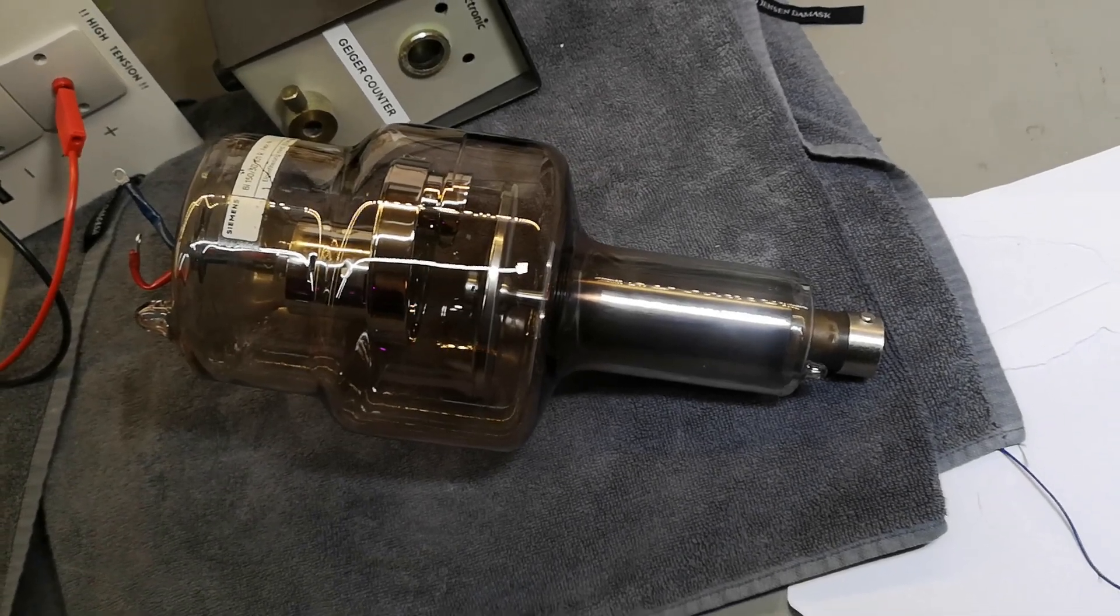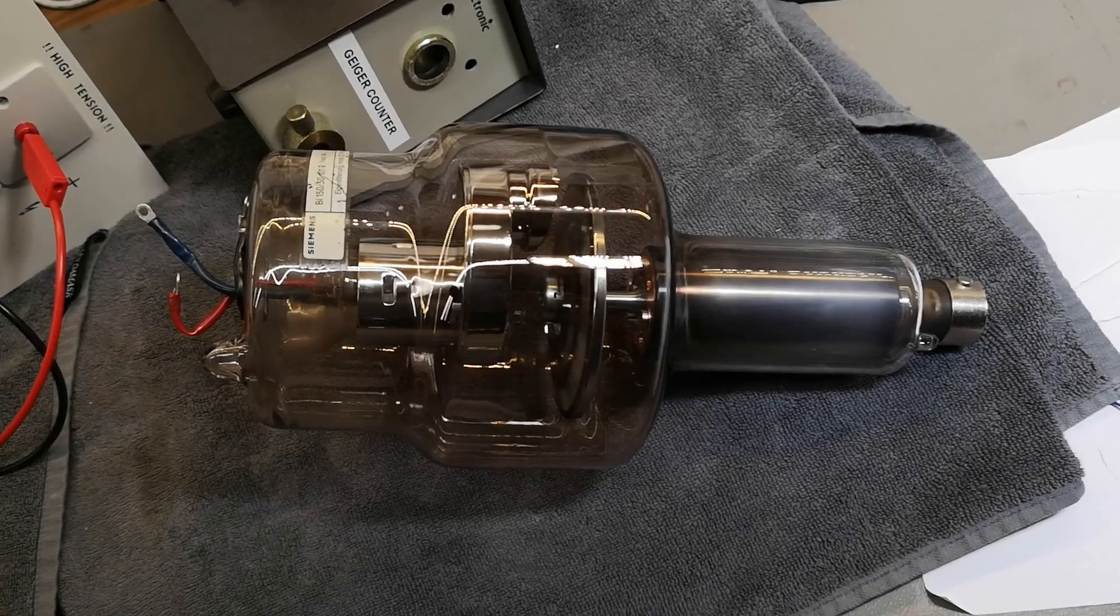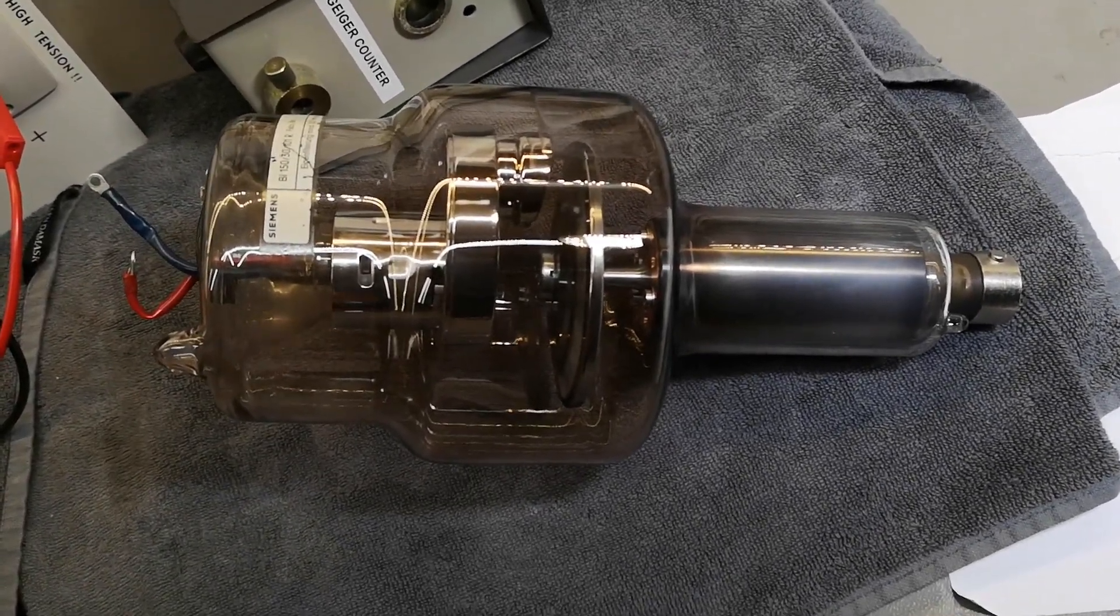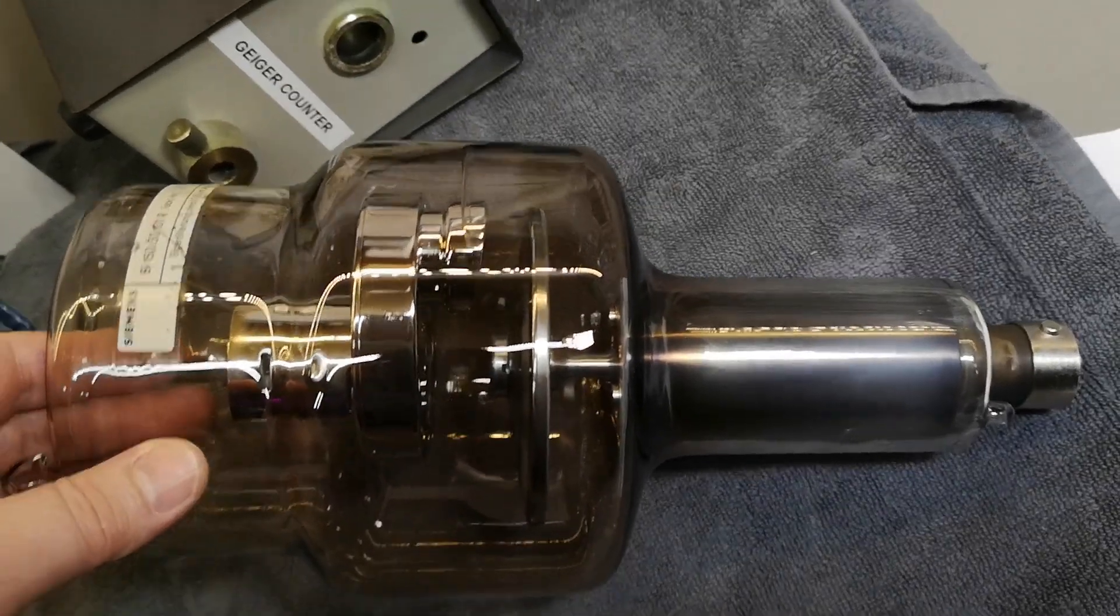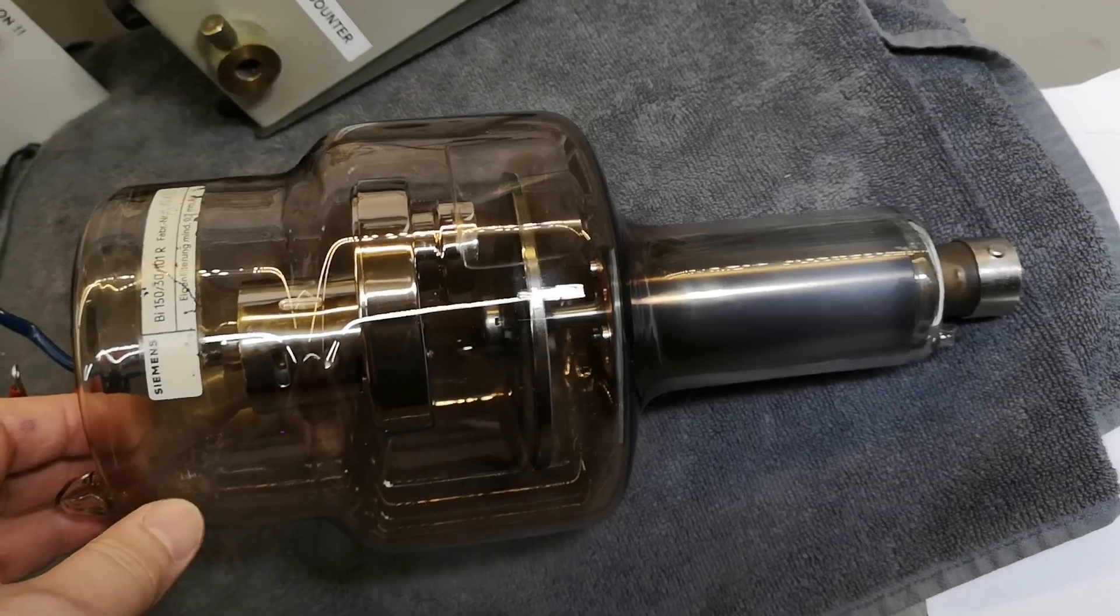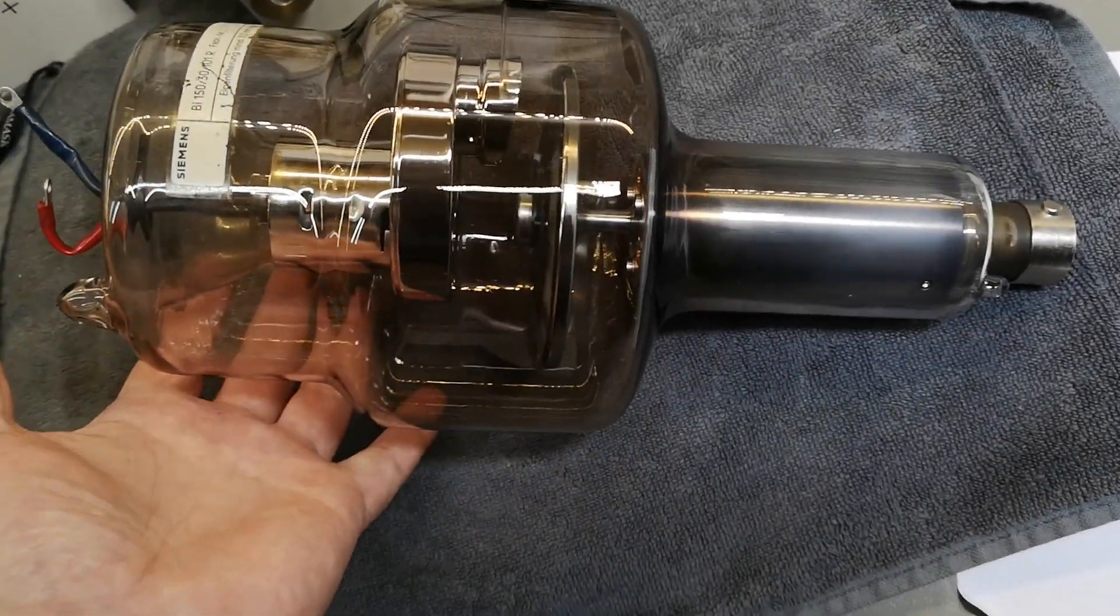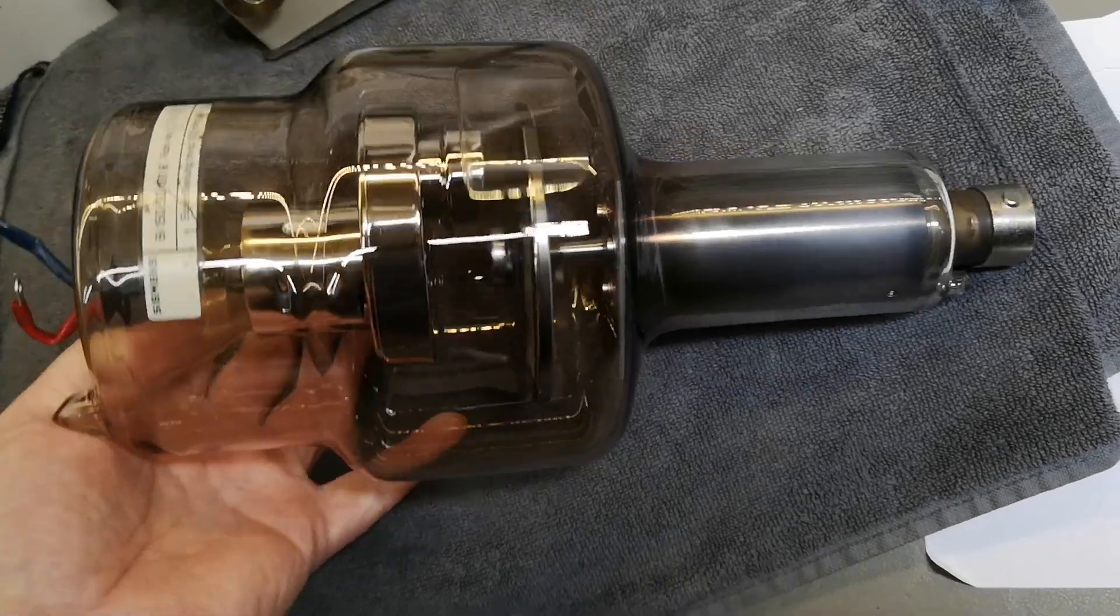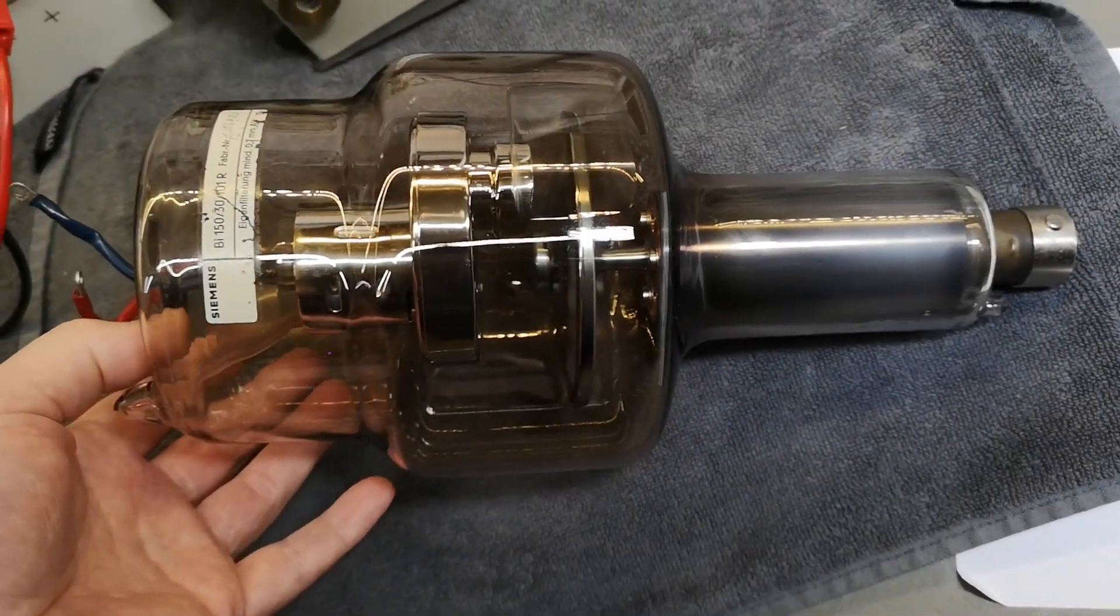Welcome to a new test and teardown video. I'm going to play a little bit with this really nice X-ray tube. As you can see, it's really big and very, very heavy, especially down at this end.